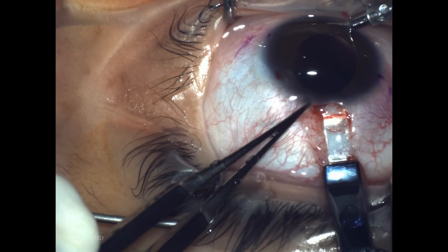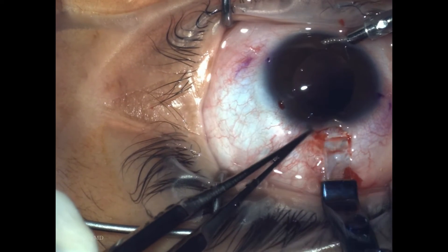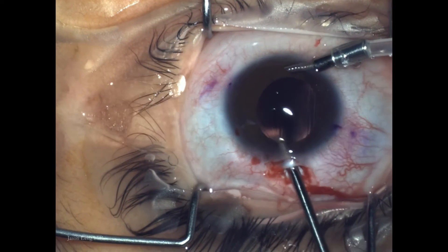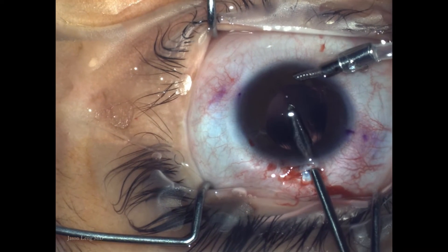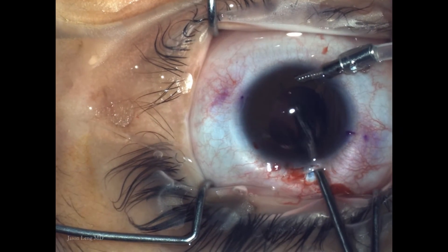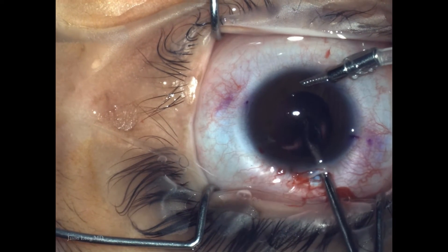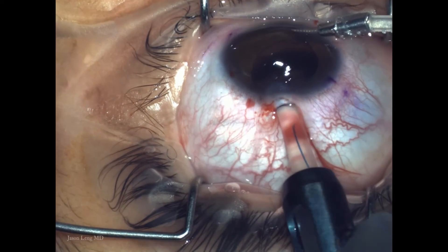This particular patient was a 20-year-old female with congenital cataracts that were removed when she was 7 years old, so she's been aphakic ever since. I start off by using a little anterior vitrectomy to make more space in the vitreous.